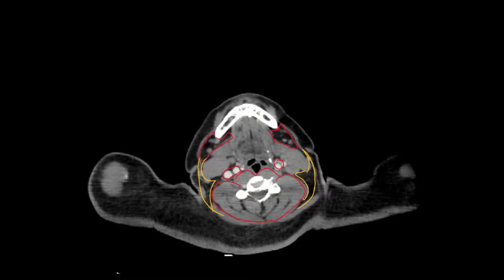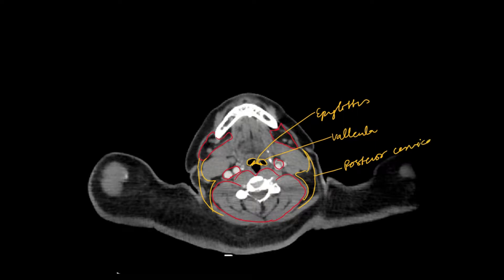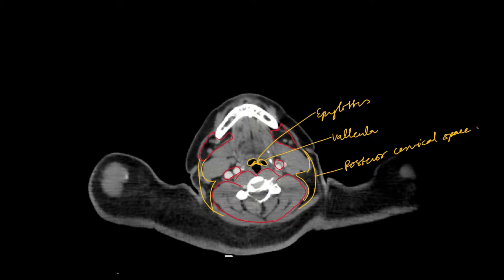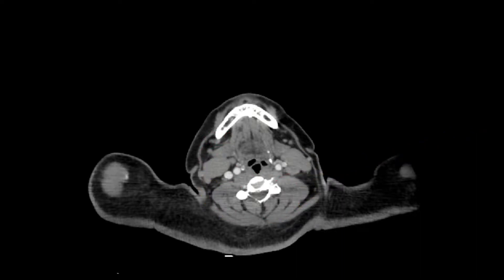You also need to look at this — this is the epiglottis, and these are the valleculae, these two small things. And this was the posterior cervical space. If you're wondering where the anterior cervical space is, the more you scroll down you will see it. So we had: valleculae, epiglottis, carotid space, submandibular space, and the posterior cervical space.